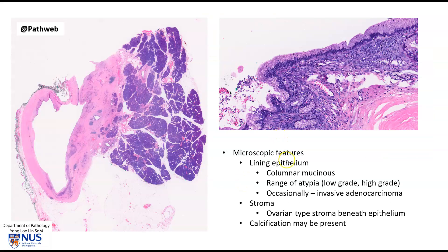Microscopically, the lining epithelium is columnar and mucinous, and there can be a range of dysplasia from low to high-grade and occasionally invasive adenocarcinoma. The stroma shows this characteristic cellular spindle cell ovarian-type stroma beneath the epithelium, and sometimes calcifications can be present.